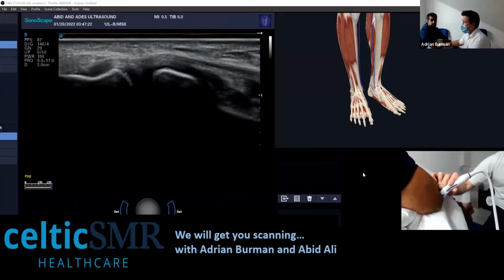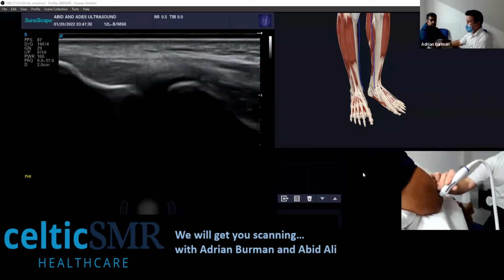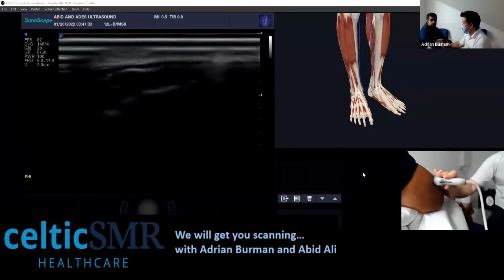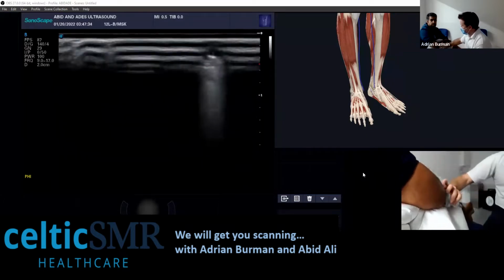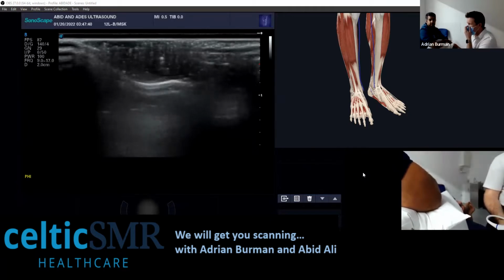I don't have any fixed numbers for this, but I would compare it with the other side, getting the same position and comparing it with the other side. If there's any difference, then I'd say that. Just practically saying what you see. Yeah, exactly. It's very individual.